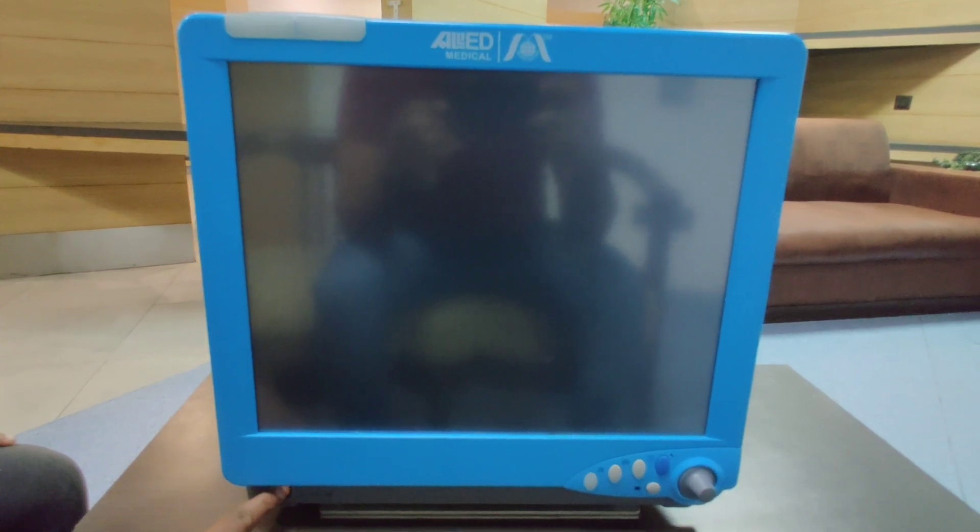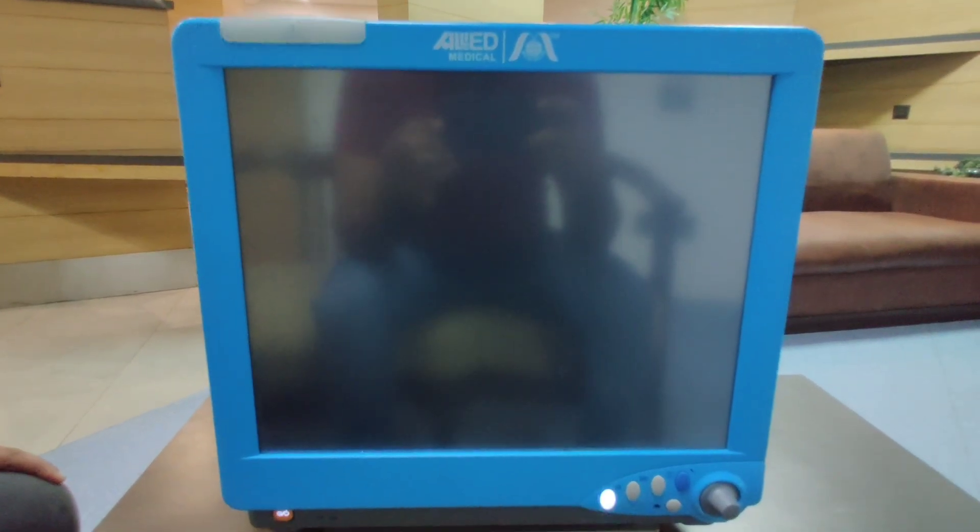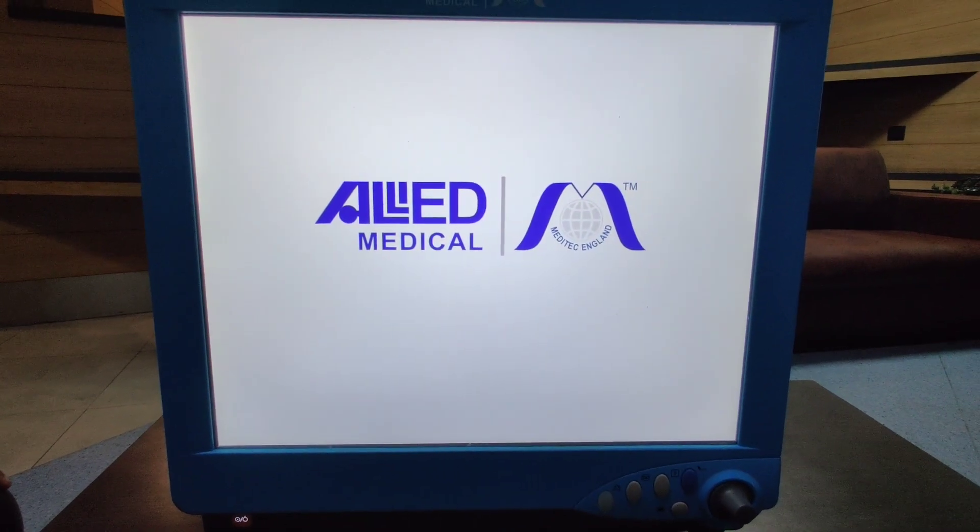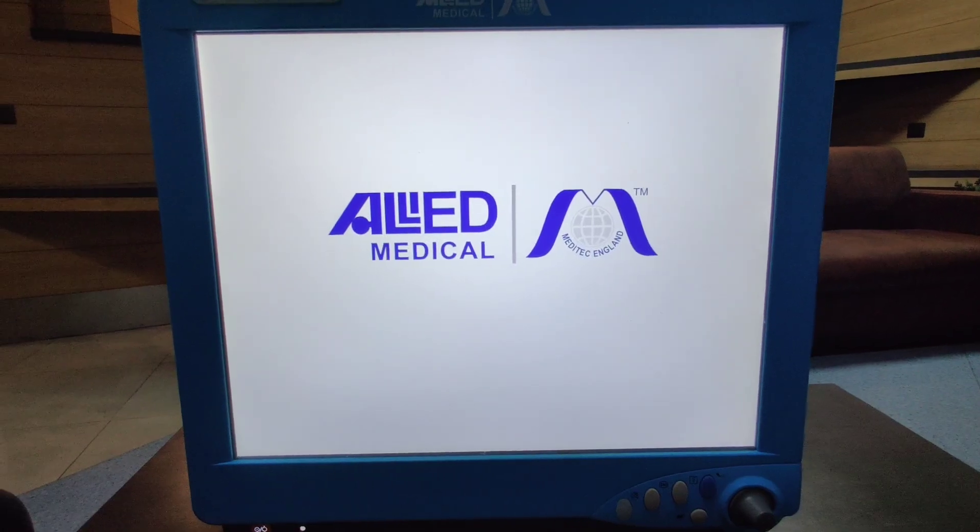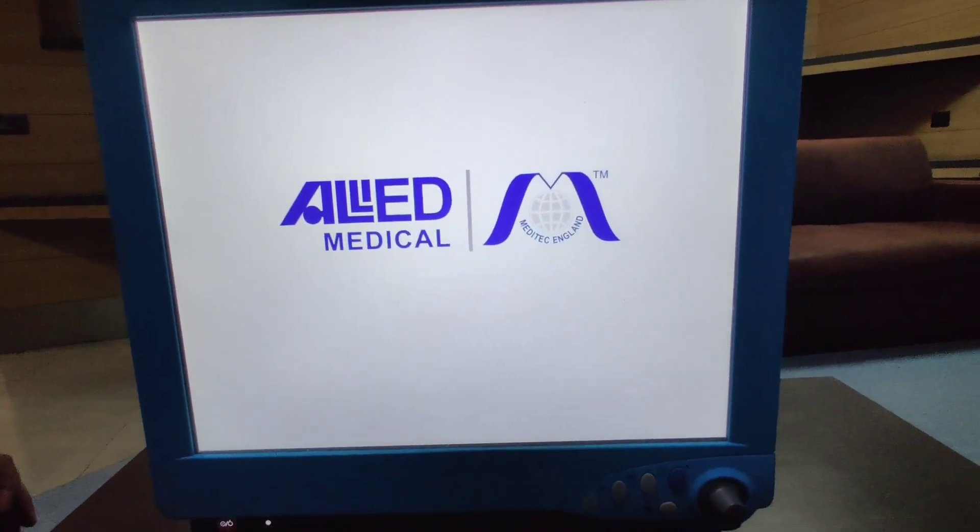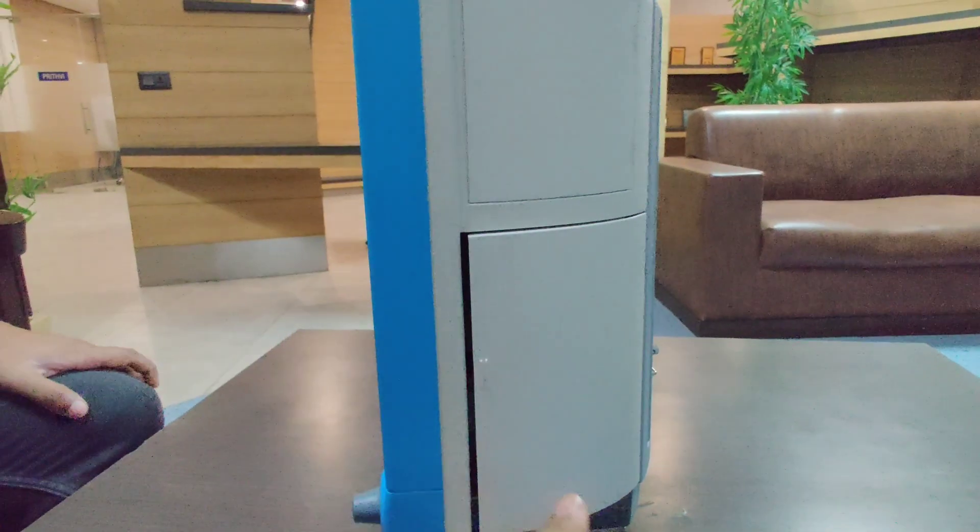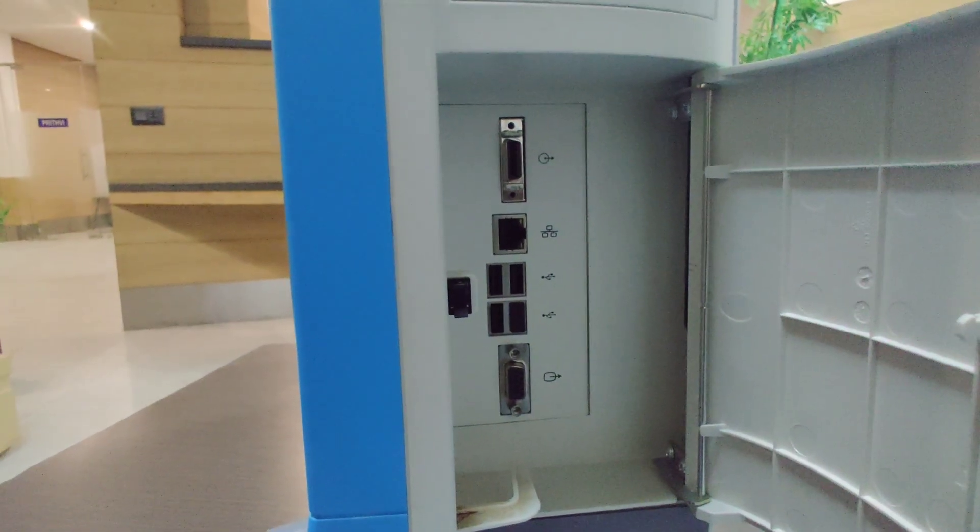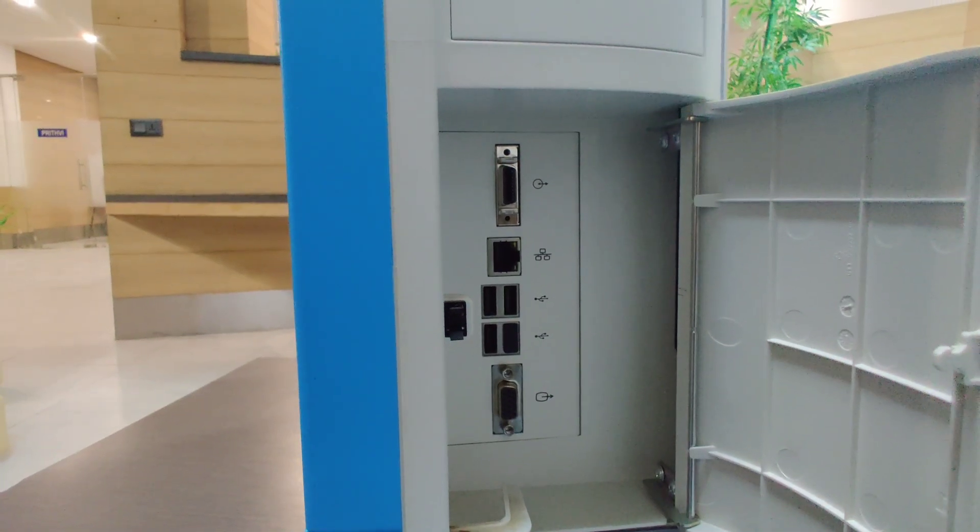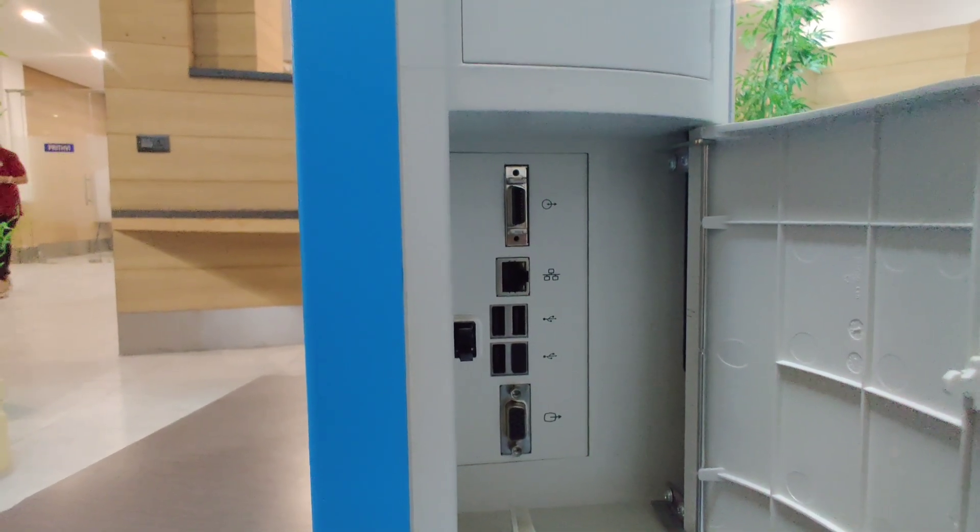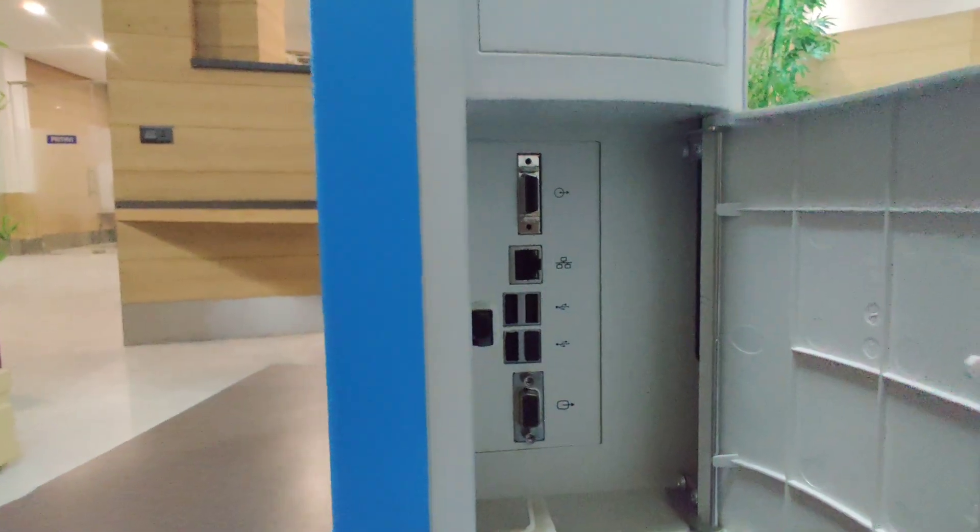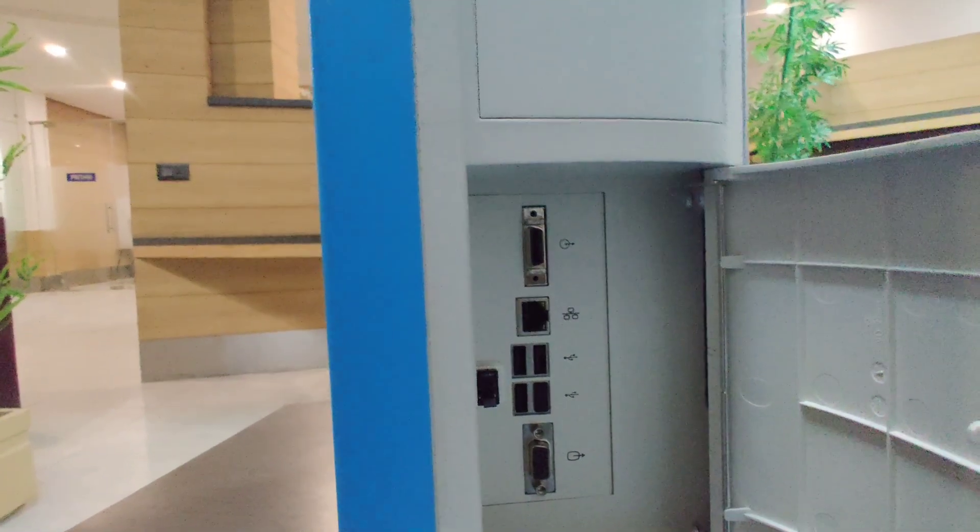On the right side we have the connectors for the interfacing. These are the connectors for USB, for connecting it with the CMS system and for connecting it with the slave display. We have four numbers of USB interface connectors over here wherein you can export the data in Excel format or CMS format.